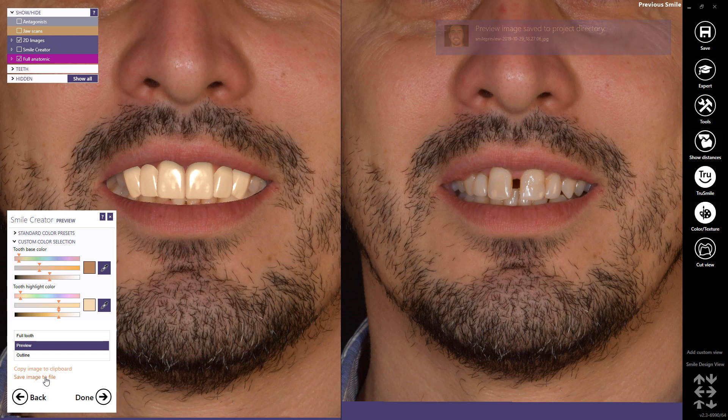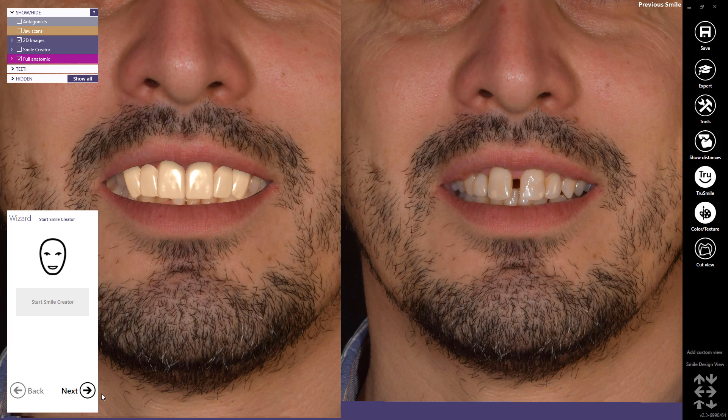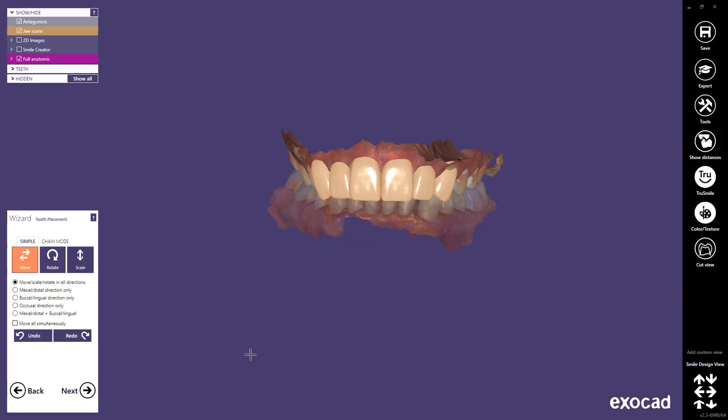Select Done to finish the smile planning. A longer and more comprehensive tutorial is available in a separate video. Select Done to finish the filming process.